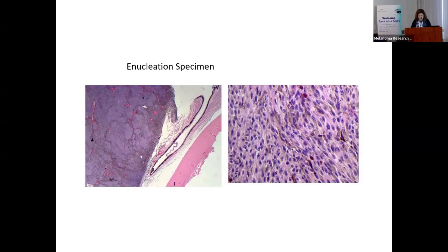And then here is an image I thought to put in for completeness that is from an eye that's been resected. So here is a tumor. It's a mass in the eye, and this is an enucleation specimen. And at higher magnification on this side, there is pigment and spindled cells, which you're now expert in seeing. And so this is an ocular melanoma that was resected.